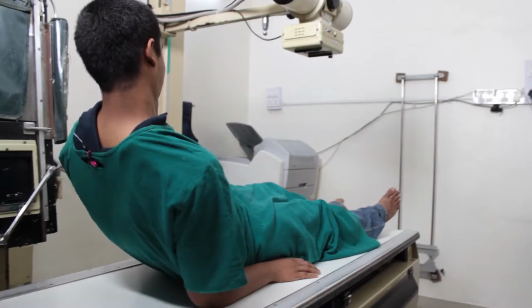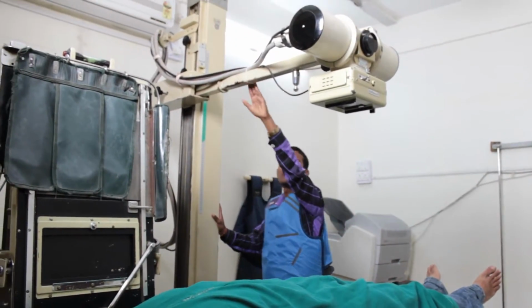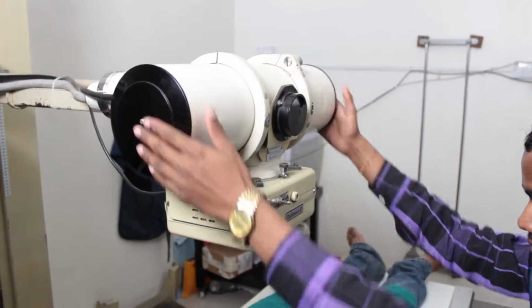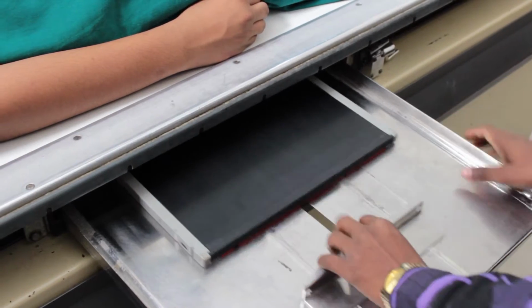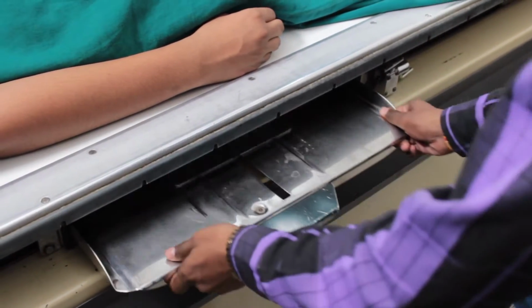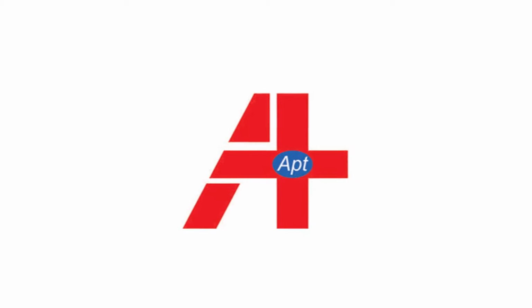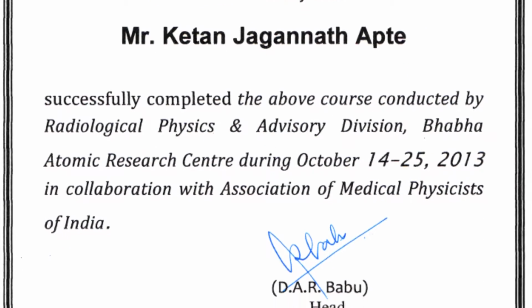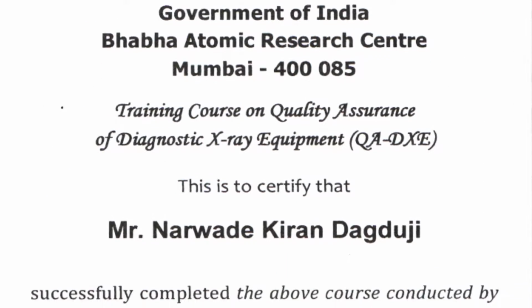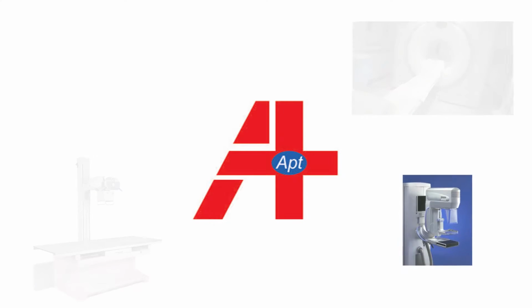To ensure a good patient diagnosis, the quality of diagnostic equipment itself needs to be checked periodically. QCheck is a quality assurance program for measuring the deviations of the various parameters of an X-ray machine from the accepted standards. QCheck is a program evolved by Apt Medical Systems, a company whose staff has been trained and then accredited by the Atomic Energy Regulatory Board (AERB) for quality assurance. Apt has an assured track record for 16 years in radiology equipments.